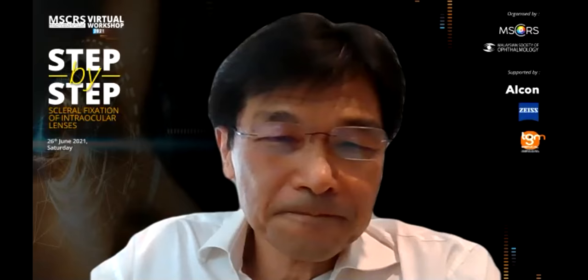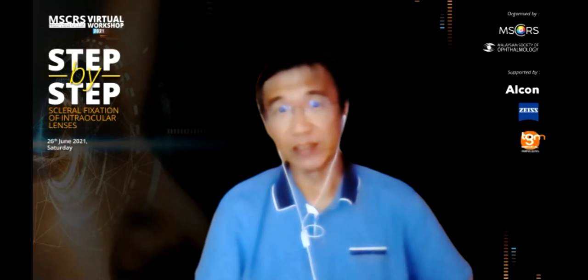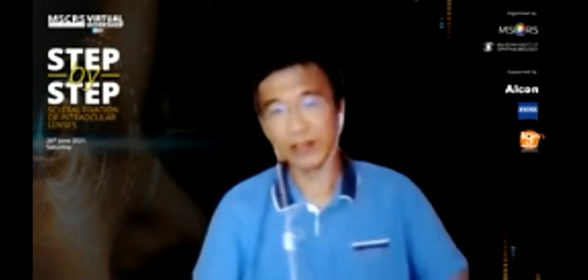Mangwai, what about surgical PI? Will you do a PI also in this type of case to prevent possible pupillary block? Yeah, I think I would. In the first case, the trap, my colleague did the PI already. And in this second one, I think there was a PI, but not obvious. I think the previous surgeon already put a PI there. So I think I would do the same.